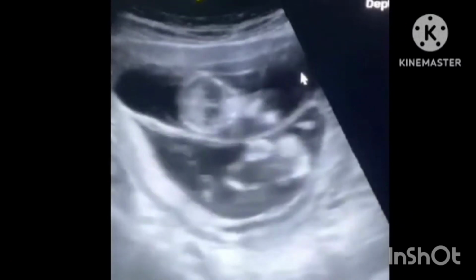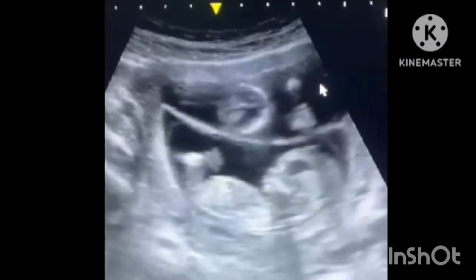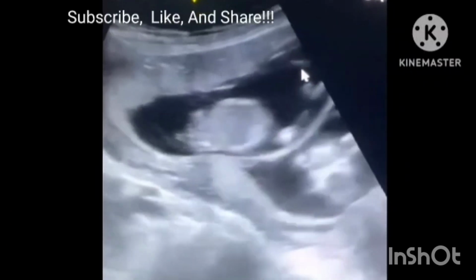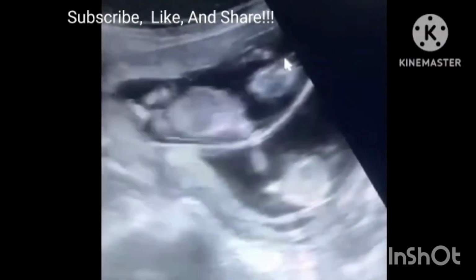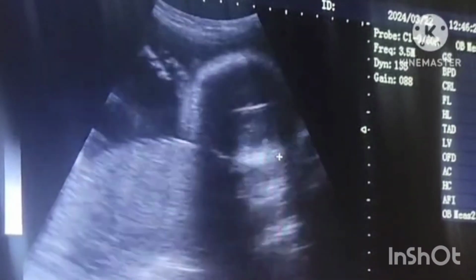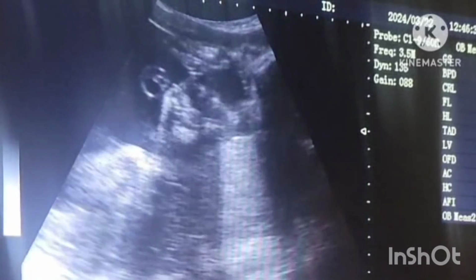Wow. Multiple pregnancy. Dichorionic, diamniotic. Baby boy for sure. An active baby, with fingers towards mouth, intending to suck a finger.